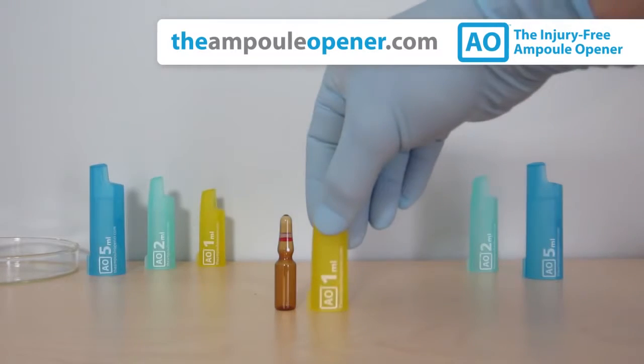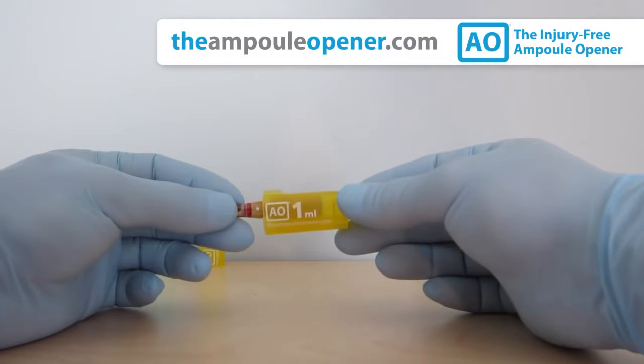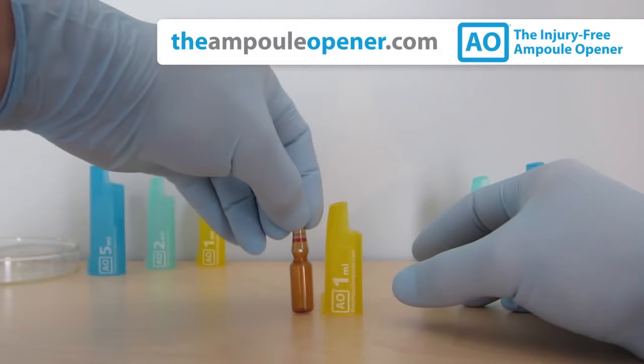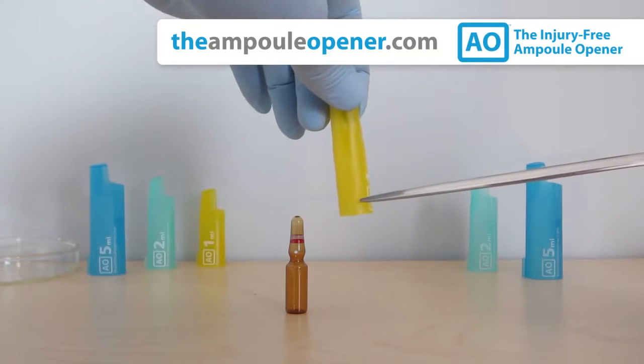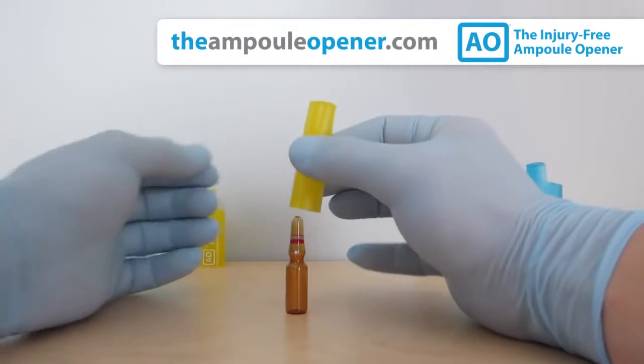To open a glass ampule, begin by selecting the proper AO and confirm that it accommodates the ampule snugly without requiring force. We'll use the 1 mL AO since we're breaking a 1 mL ampule. Be sure to identify the DIN dot on the ampule and face it towards you. As you slide the AO over the ampule, align the AO's tab with the dot on the ampule to ensure a clean break.